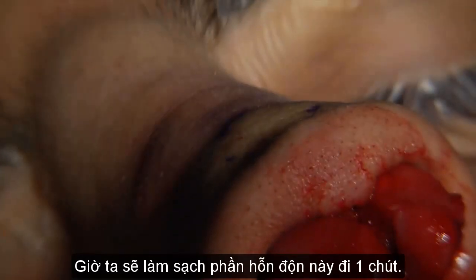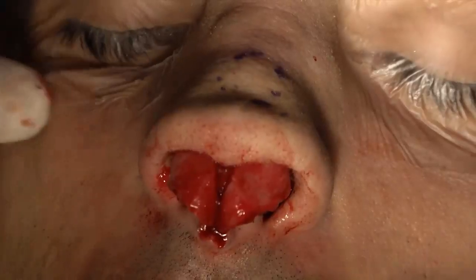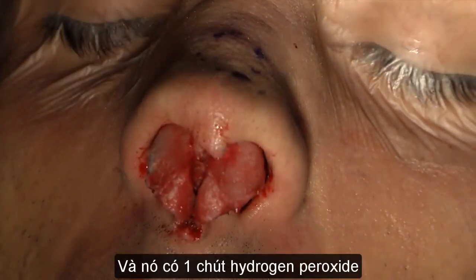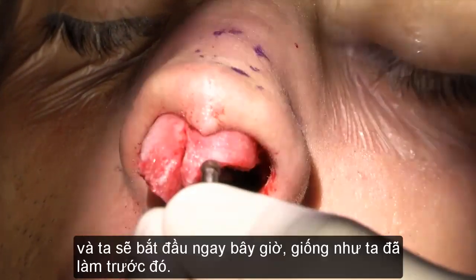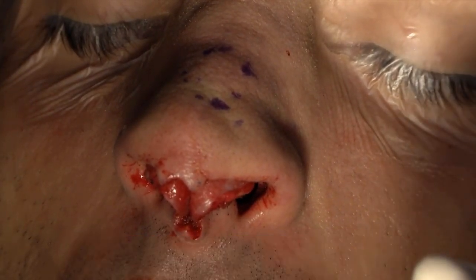Bene, puliamo. So let's clean this up, this mess a little bit. You see we put Opsite everywhere, on the eyes and on the mouth. And this has a little bit of hydrogen peroxide. So, let's start now, in the same way as we did before.